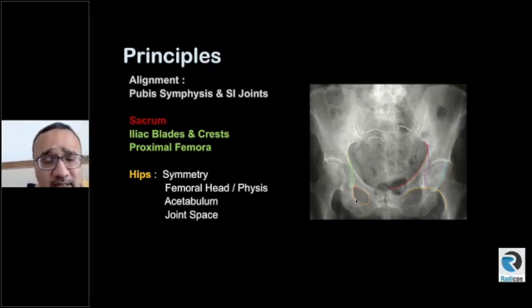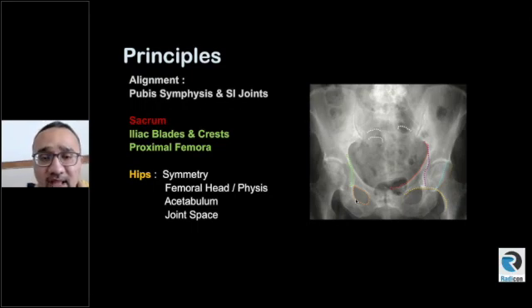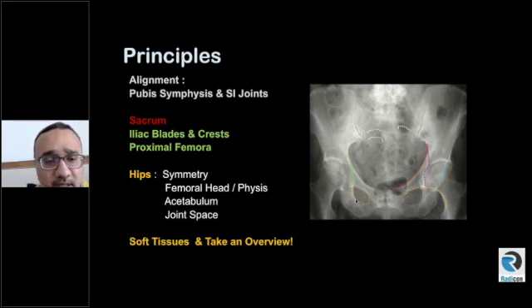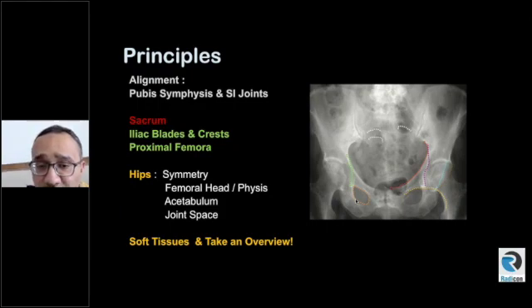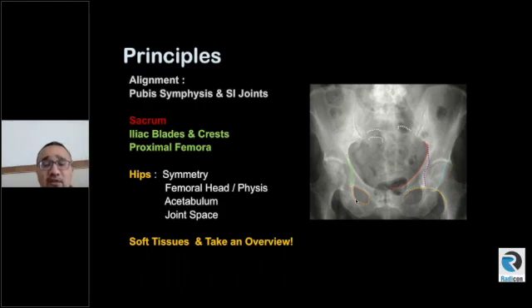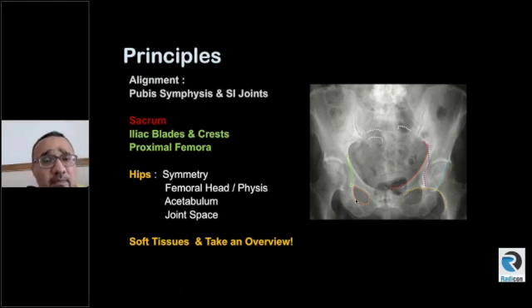This is not a strict scheme, but the point is you have to have a scheme — your own scheme in mind — so that you don't miss any abnormality. Remember these review areas: sacrum, iliac blades, proximal femora, and also look at the soft tissues around the hip. It's also important to stand away from the film and take an overview — is there anything that is just standing out? So now we're going to go through these things one by one.